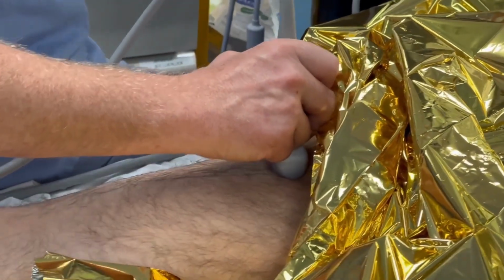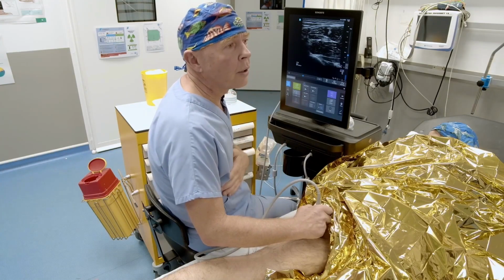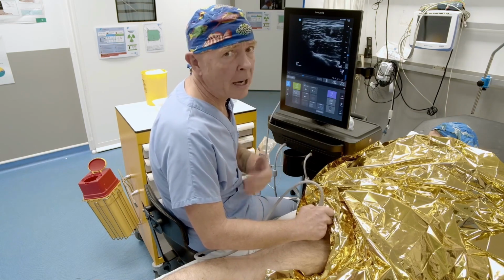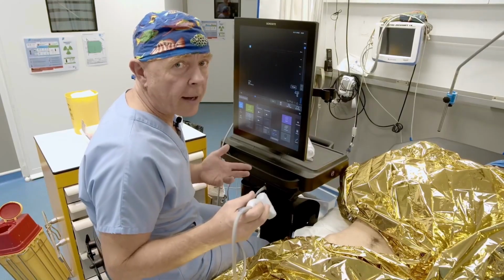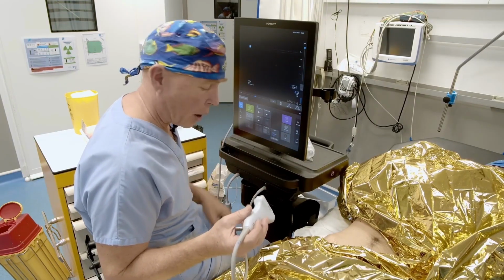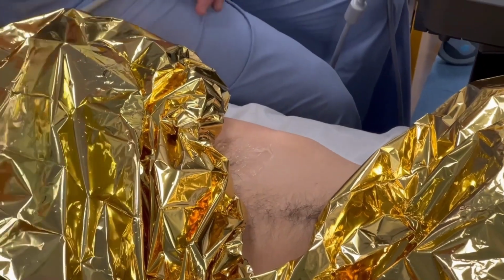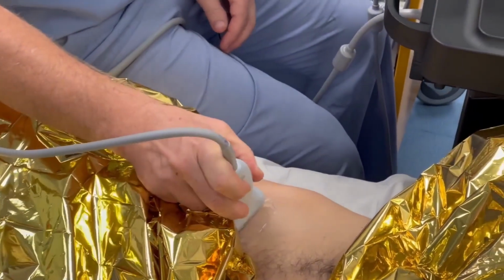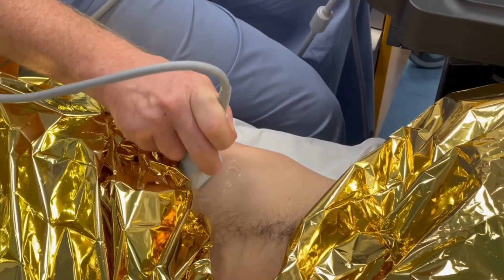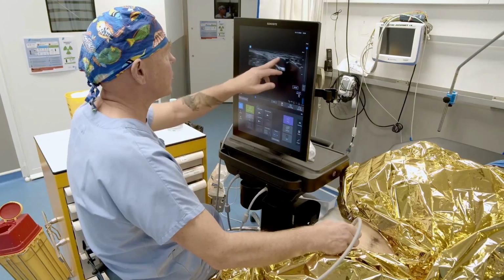So now we're going to turn around and do the femoral block and the iliofascial block via the suprainguinal approach, and we'll finish with the table. So now we're going to move on to the practical workshop for the femoral nerve block. You see the position of the probe as always, my landmark on the outer side and my hand firmly stable on the patient. We can identify the anatomical structures, and we can rock the probe a bit to see everything. My main landmark is therefore the femoral artery.